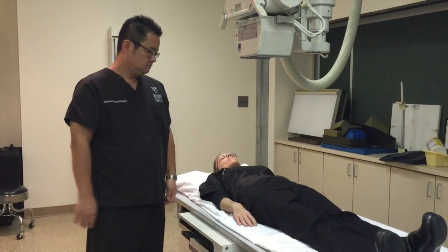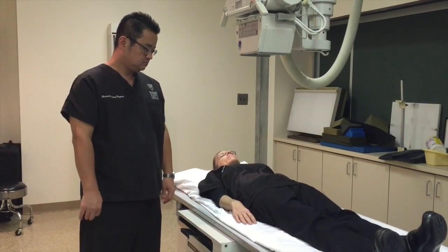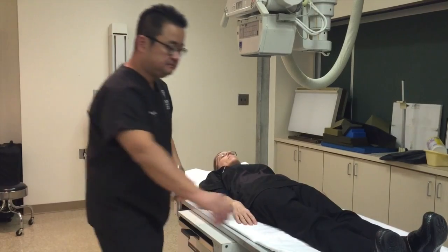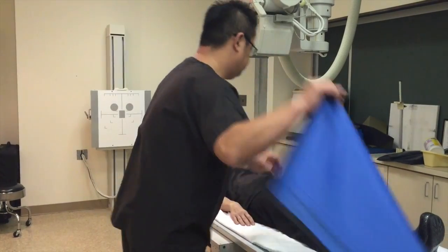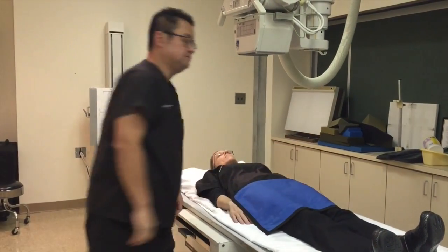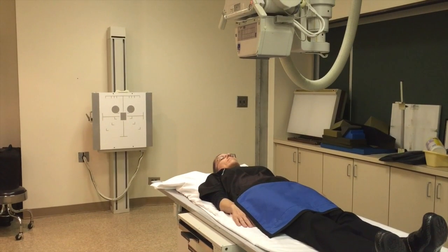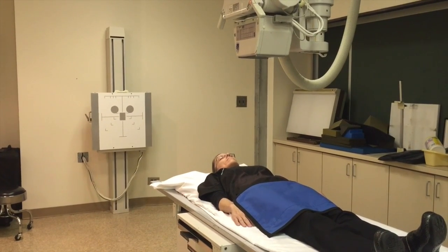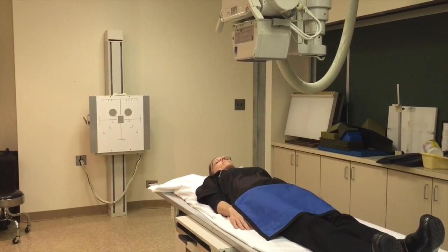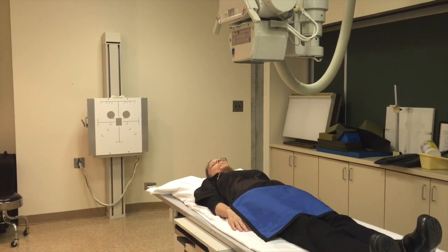The level of L1 and L2 is halfway between the xiphoid process and iliac crest. The technologist will set the technique at 80 kVp and 25 mAs, then give breathing instructions: deep breath in, blow it out, and hold it out. Breathe.